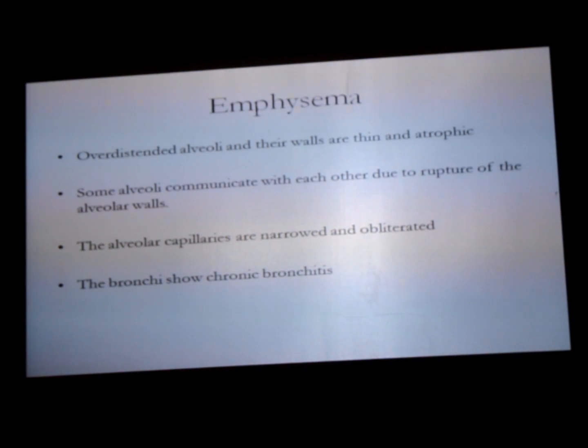So many alveoli communicate with each other. They form a big lesion inside. Here you can see a lot of ruptured alveoli. They have formed a big lesion and they communicate with each other. This is what we see inside the emphysema.